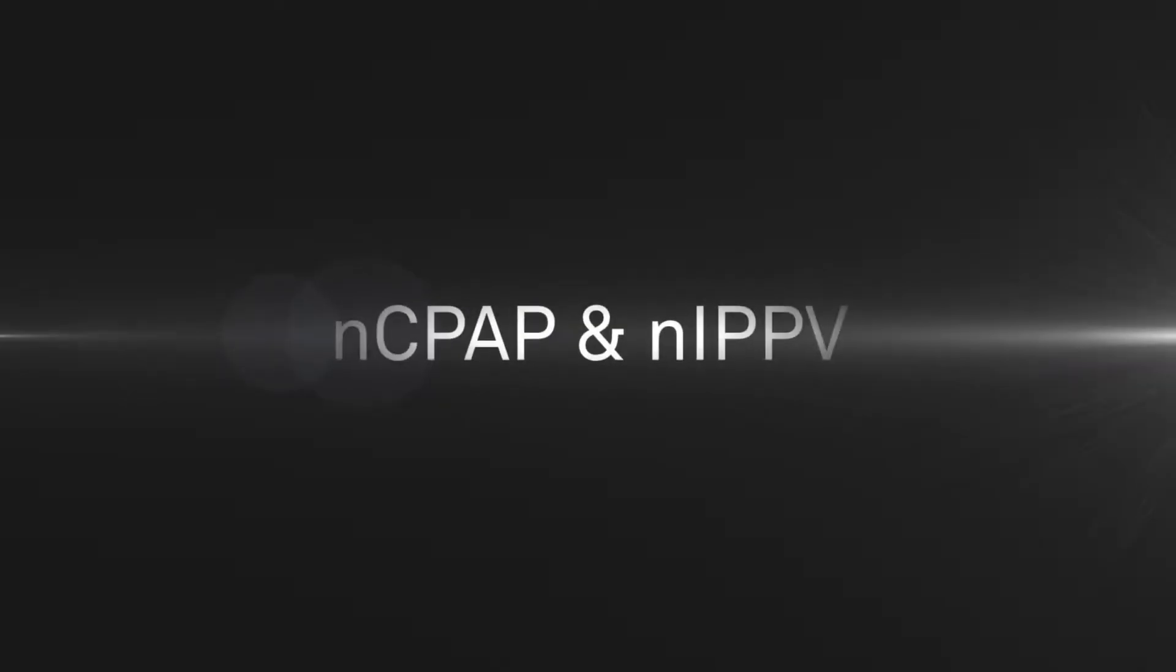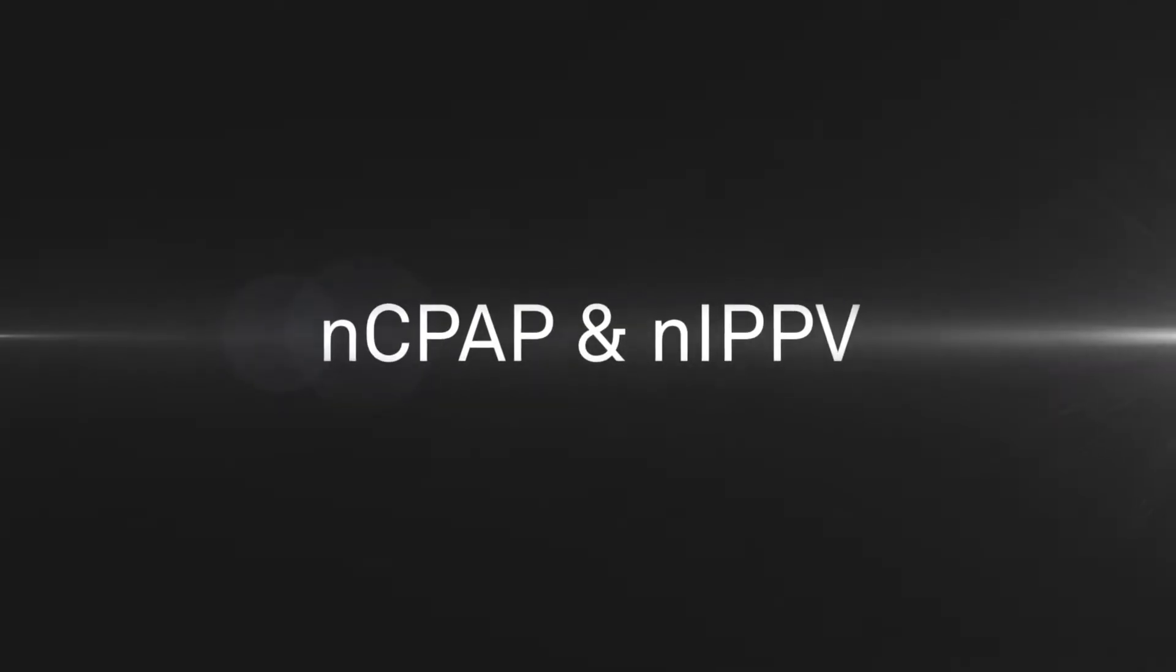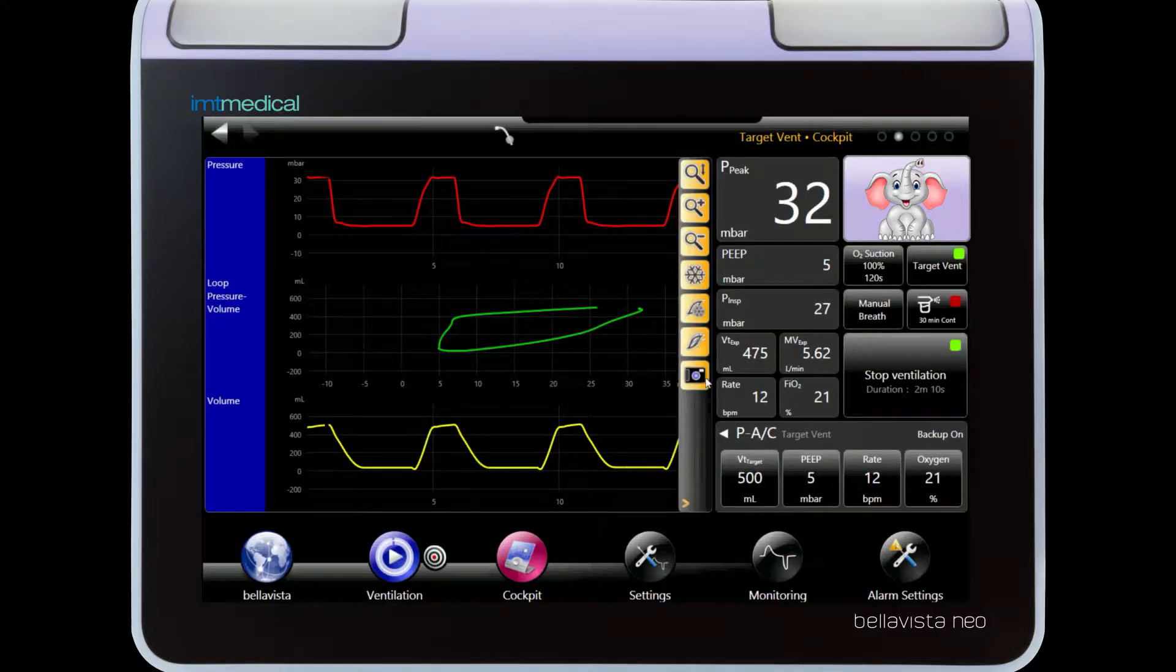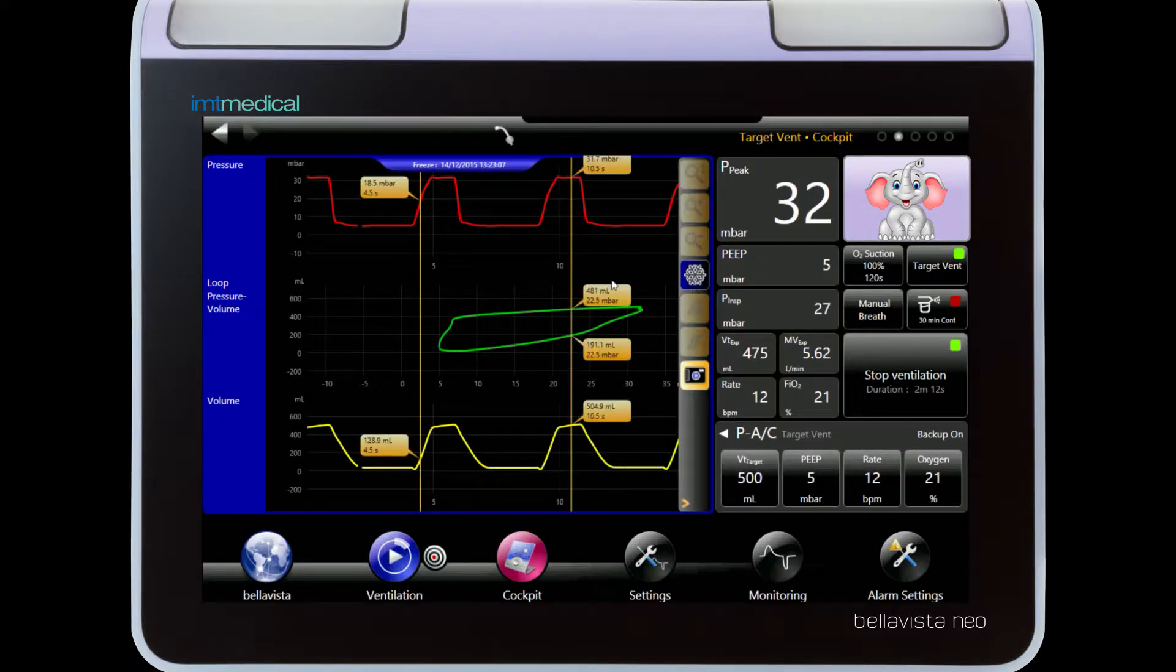The NC-PAP mode features a breath rate detection and gives you additional safety through apnea alarming.